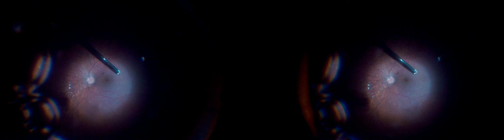Retina periphery was reached again, now to go ahead with an economic and focal retinotomy. The cutter lifts the retina up towards its tip, thus helping control shear forces by keeping it still, not grabbing excessive tissue, and at that point avoiding fluid shear stress on the retina. Cutter tip moves sideways so as to make a uniform retinotomy of 2 clock hours.